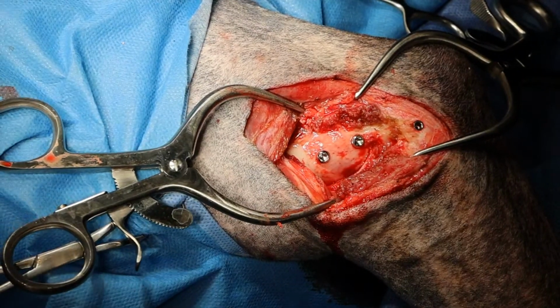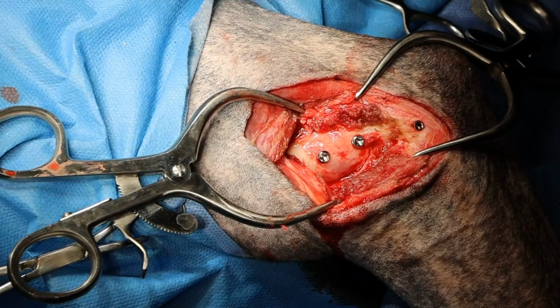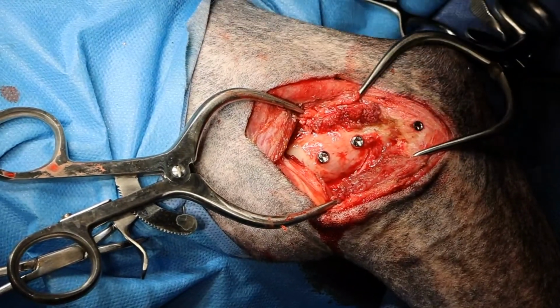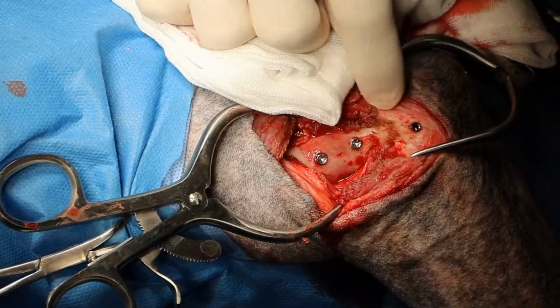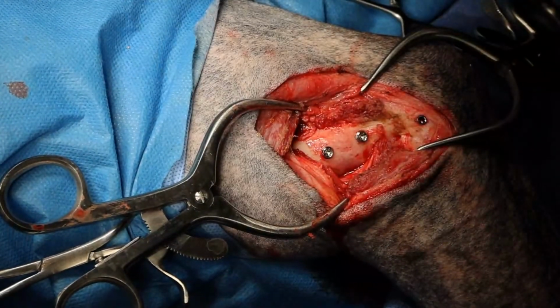C-shaped incision on the caudal aspect of the elbow to approach the elbow to get access to the condyles. C-shape, I assume that you mean back here. Yes, you probably can. If that's what I understand, just cutting more through the insertion rather than the body of the muscle. There, you probably can do something like that.